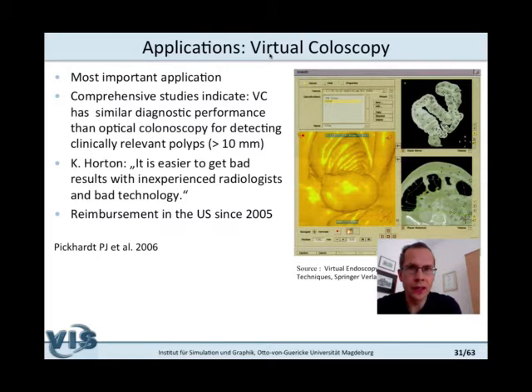We discussed in the last video lecture what virtual endoscopy is, strongly inspired by real endoscopy. One tries to investigate air-filled or fluid-filled structures like the colon or the bronchial tree. Navigation is quite important. We are inside such elongated, strongly curved or even branching structures.